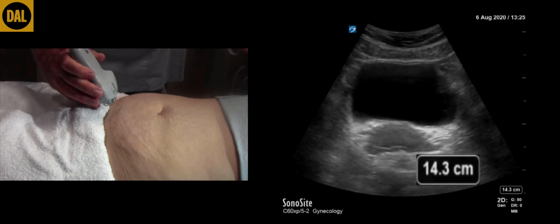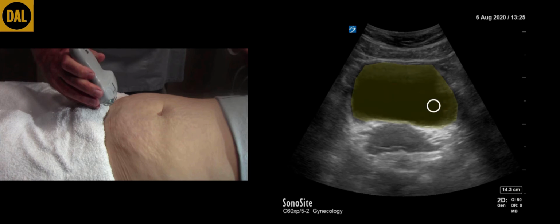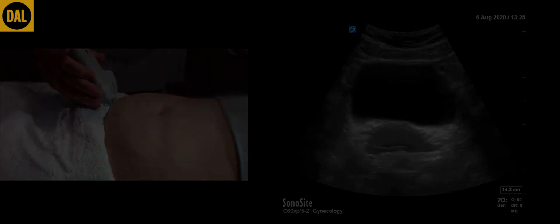The depth should initially be set to maximum and then adjusted to optimize the image according to patient body habitus. This scan is best performed when the patient has a full bladder. The full bladder is an excellent acoustic window to the deep pelvic structures.